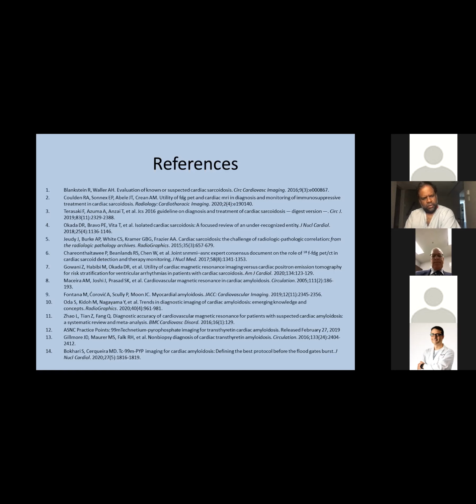Just my general thought is that I think we underutilize MR screening, and if you were to comment on what our capacity is here in St. John and how you would best suggest we would utilize.